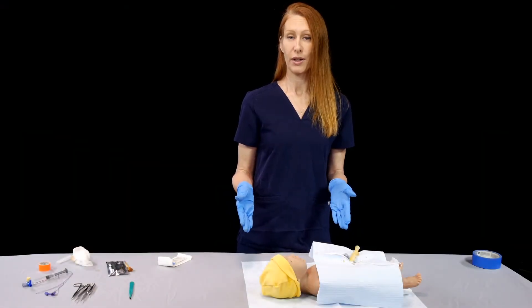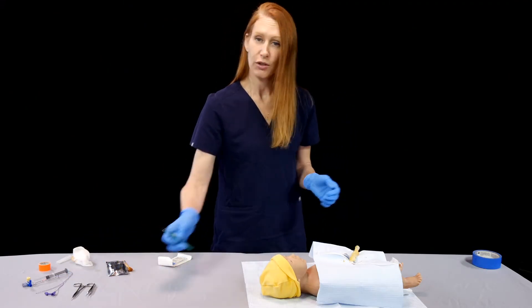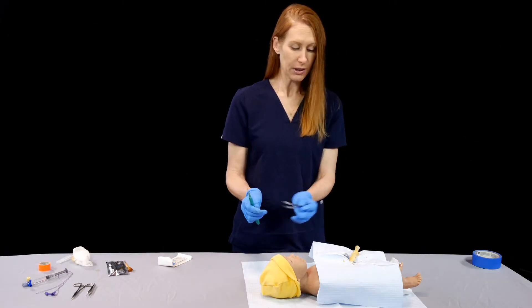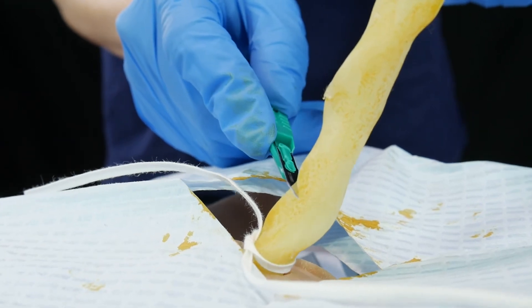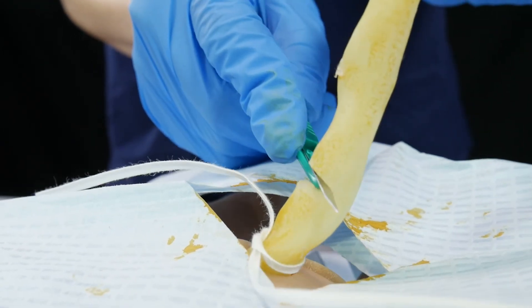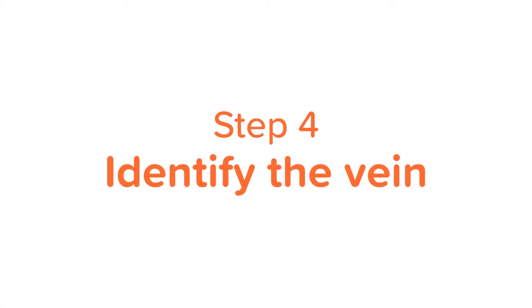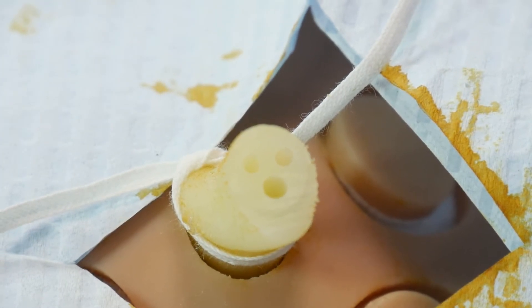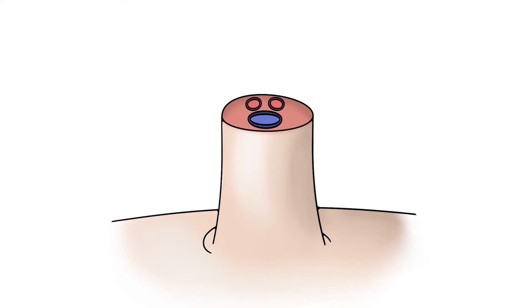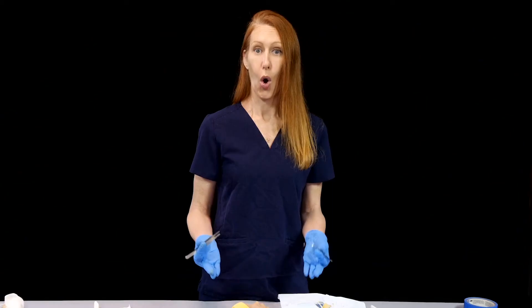Next, we need to cut the umbilical cord one to two centimeters from the base. I'm going to grab a hemostat or forceps to hold it up a little bit, and then go ahead and cut. If you take a close look at the remaining segment of the umbilical cord, you'll see the face — the two umbilical arteries making up the eyes, and the umbilical vein making up the surprised mouth.